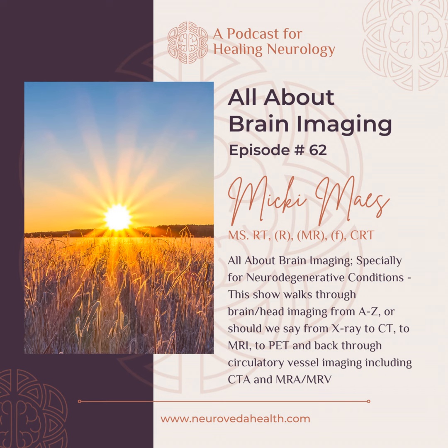Interesting. And are there clinical characteristics that correlate with a small right-sided hippocampus or a small left-sided hippocampus? Yes, that's a great question. Seizures are the thing that we're normally going to associate with that sort of asymmetry. So we have a seizure report. It's really targeting temporal lobe epilepsy, any type of hippocampal sclerosis, and unilateral degenerative conditions.